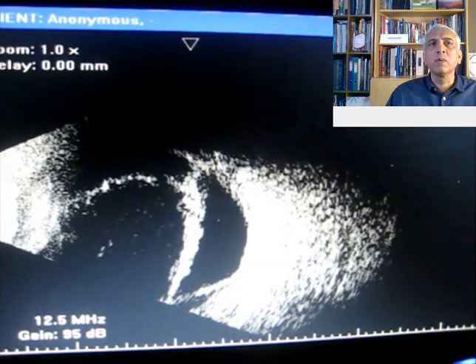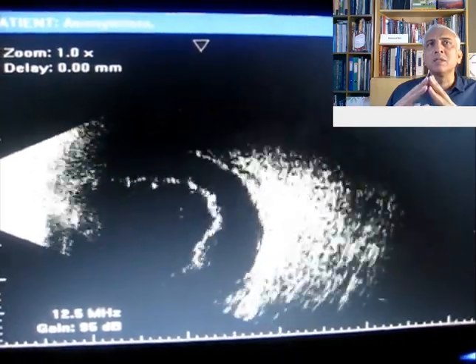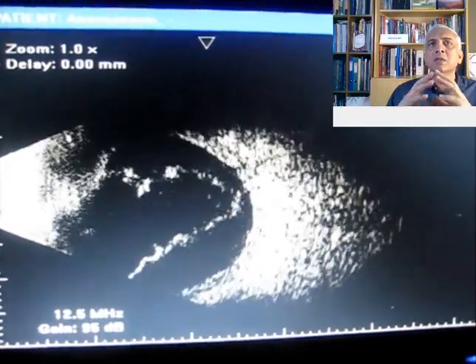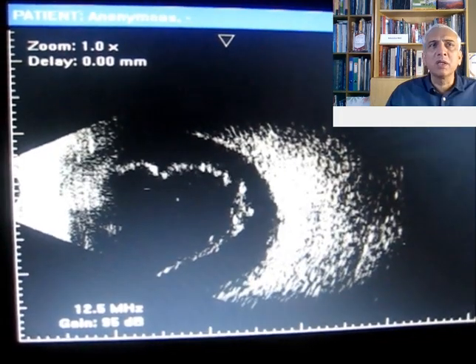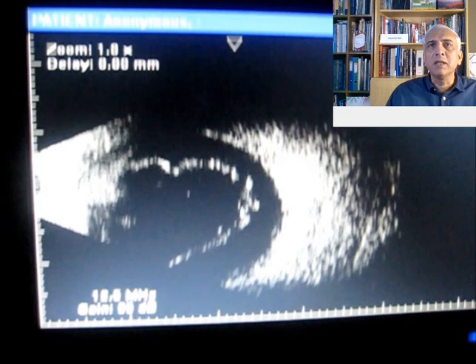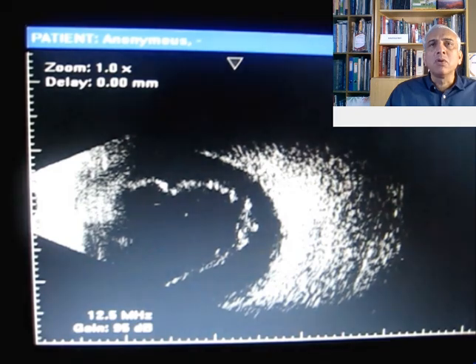If we move this forward, what we'll see is this moves when you move the eye, but the movement is not very brisk or not 100% mobile. So this is a retinal detachment because it tends to get restricted when you go into that movement, compared to if this was a PVD. In that kind of case, you would see more fluent movement. The undulations will be much more. And the other thing which is important, this is the undulating appearance of the retina.